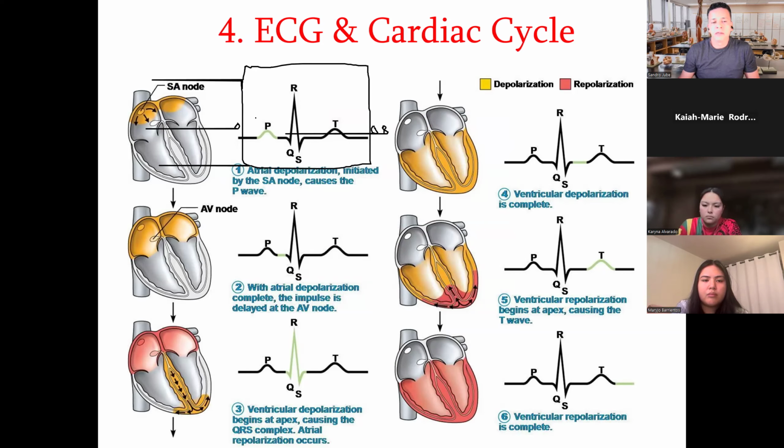And we can see here there are these different waves within the ECG. What is the first wave right here? This first wave, called the P wave, represents atrial depolarization. What is atrial depolarization? First of all, depolarization means the opening of the sodium channels in the cells of the atria, allowing sodium to enter the cell and leading to the formation of a new action potential.